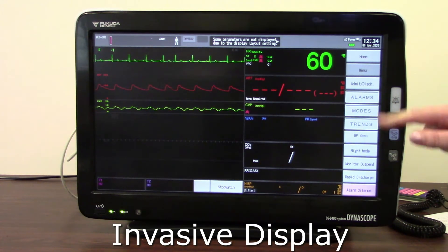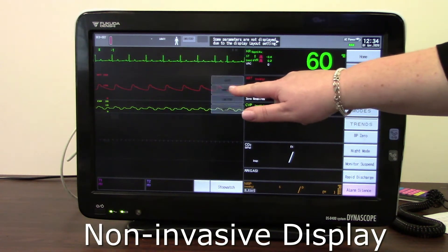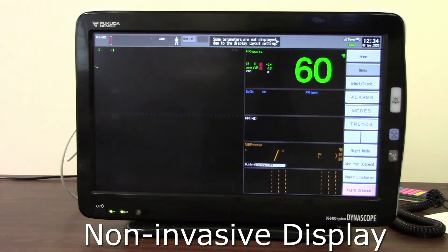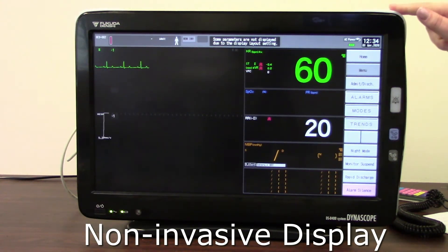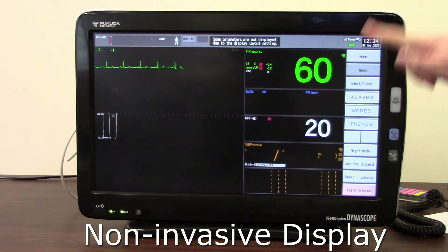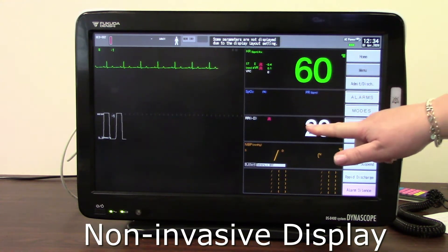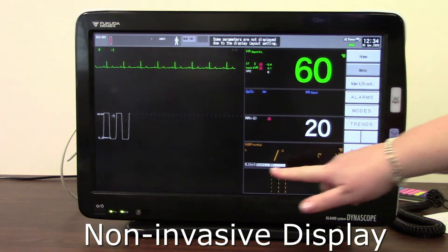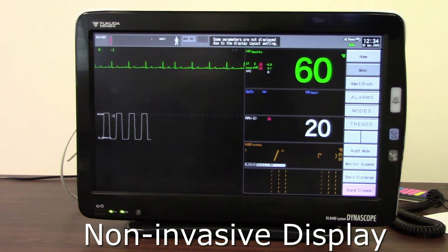If I touch again, I can then look at my non-invasive display. As you can see, nice big numbers — we've got our heart rate, SATs, respiratory, NIBP, and a large non-invasive blood pressure list there as well to view.